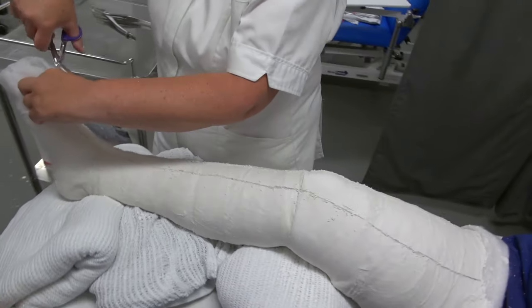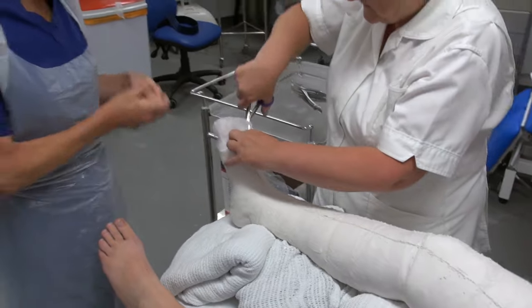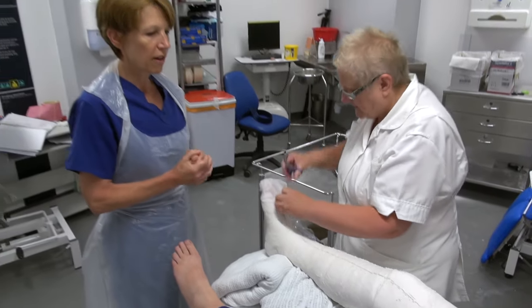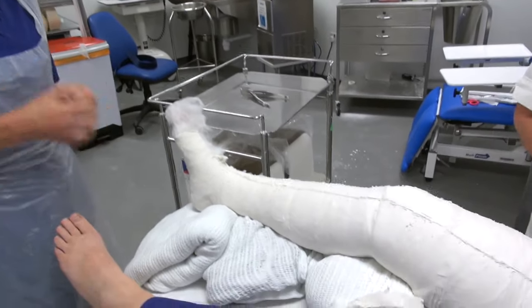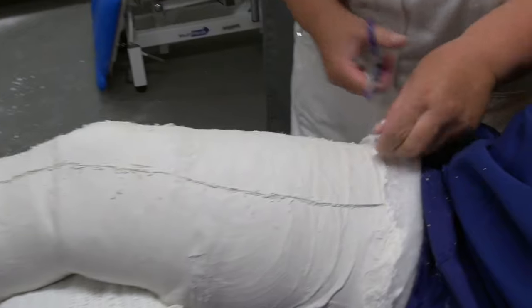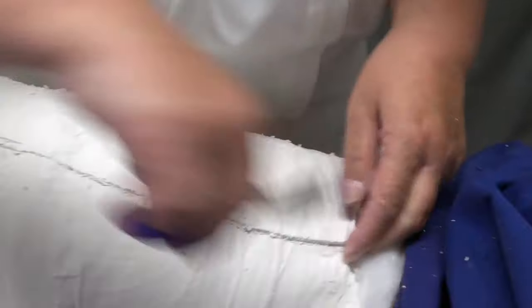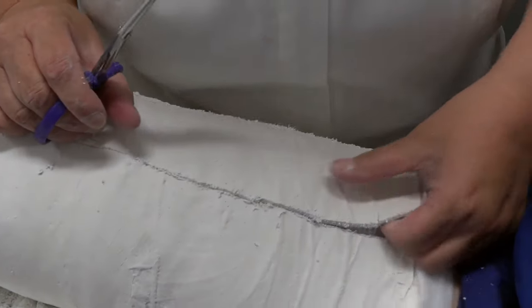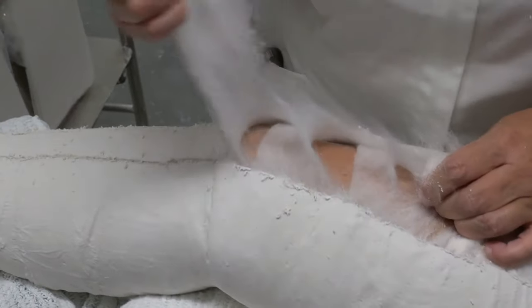You probably noticed when Pam was using the plaster saw, she was going in an up and down motion and not dragging it from side to side. If you drag it from side to side you're at risk of getting a wound underneath, so it's an up and down motion. She's put two lines down to split the cast, creating a tram line, and now she's going to remove that section which will allow for any swelling that's going to occur.